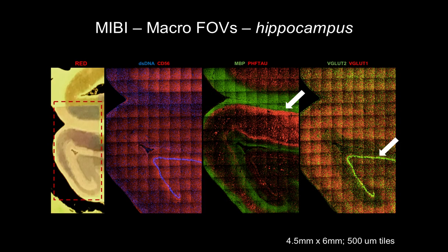Going over to the hippocampus, we can follow the same progression. Again, you can see the characteristic shape here. It's a lot easier for me to identify, though it's still tricky. Sometimes I need to be told by the neuropathologists we work with which way I'm looking at it. This was acquired much the same as we did the midbrain region.